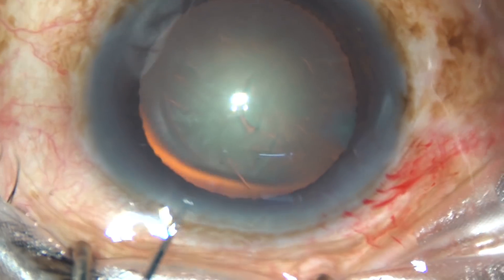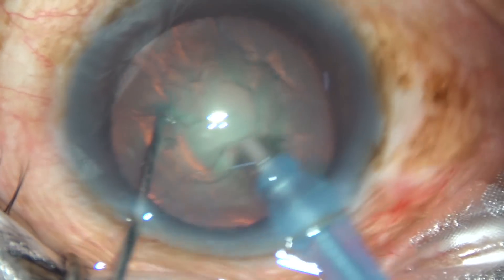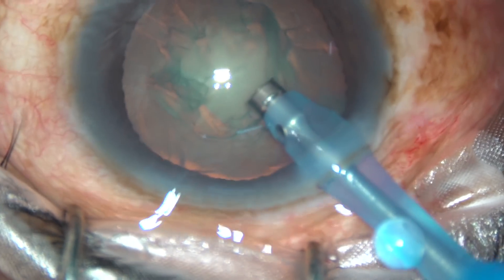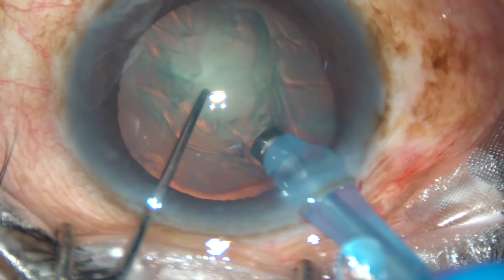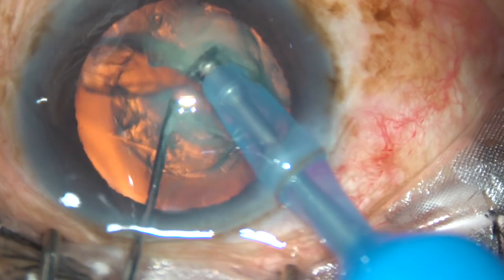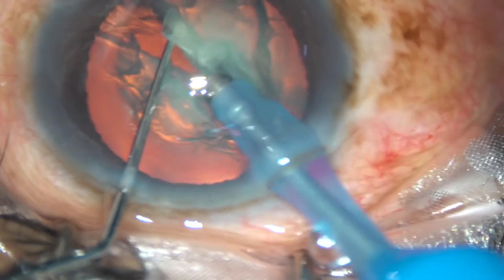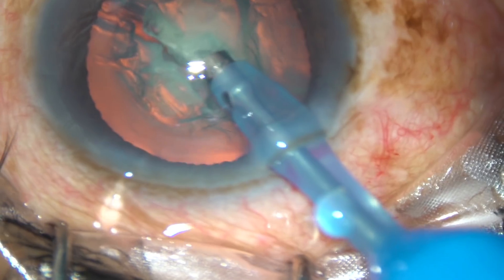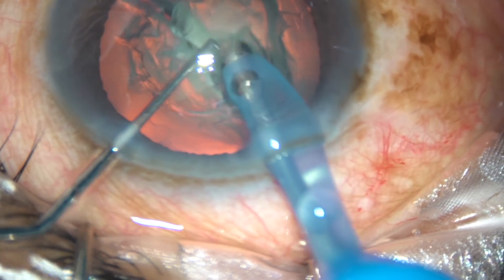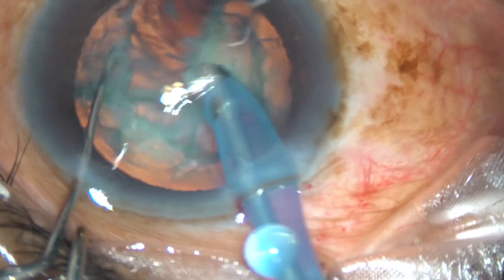The bevel is towards the nuclear mass. Some cortical matter has been removed. Now the bevel is turned towards the corneal endothelium. The tip is buried into the substance of the nucleus and the nucleus is chopped. Now, stay there for a few seconds so that fluid goes through this crack from center to periphery — you can see this is reverse hydro. Now, this is a chop towards 7 o'clock.